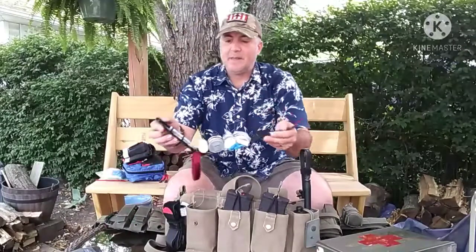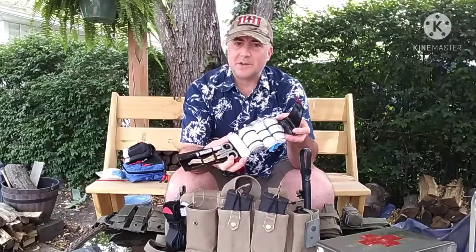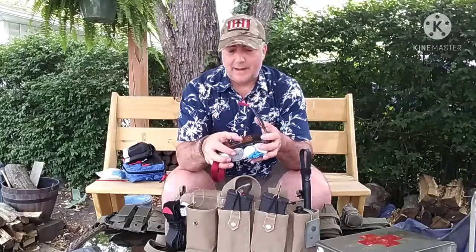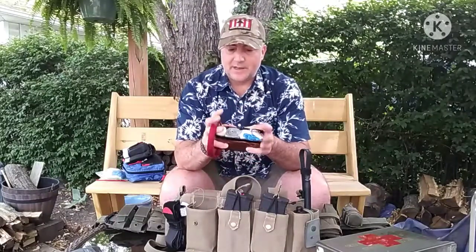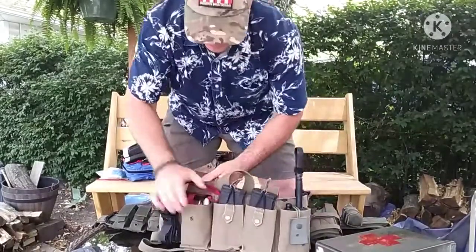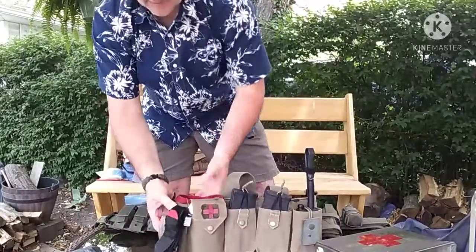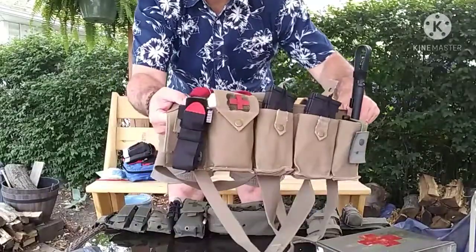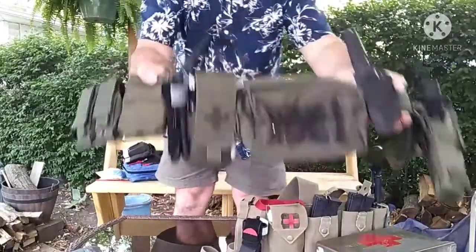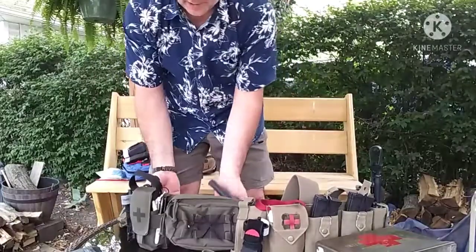On this one here, a little bit of a different setup. Same purposes, but just set up a little bit differently. I have a pair of shears inside of the kit there. That works out well. You can do it any way you want, to be honest with you. That's just the way that I've been doing it. And once again, drop that into your pouch. Bam. Secure it. And then, of course, I keep a tourniquet on everything right next to your first aid kit. So you have that there on the chest rig, you have that there on your belt line, and you're good to go.